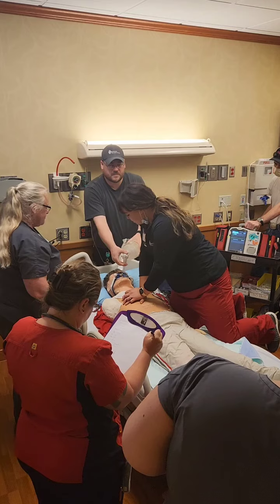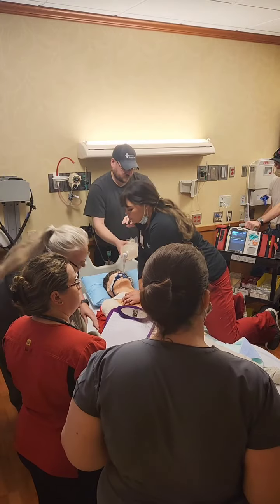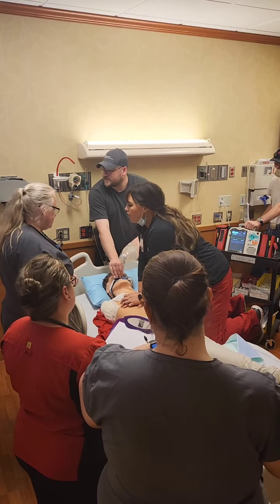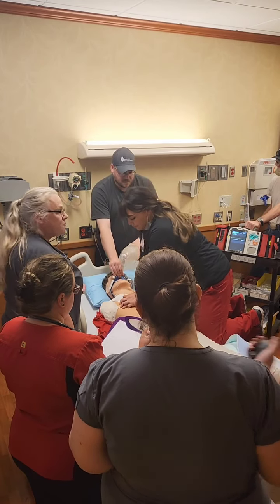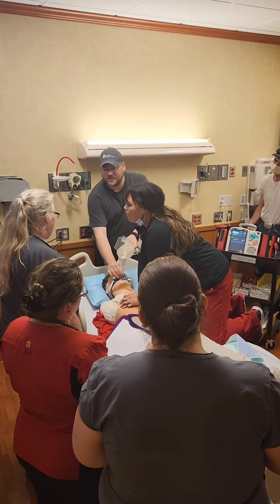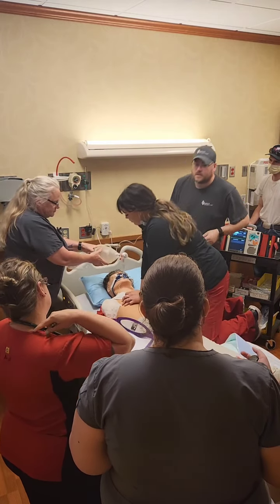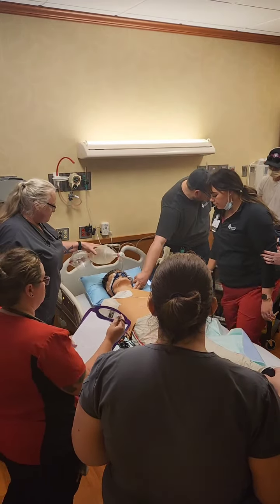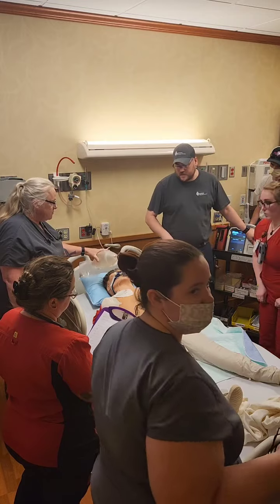Let us know when it's been 2 minutes. We have enough people out on the floor. Every 6 seconds. I just ran a check on my blood pressure. Eric, go ahead. I'll do the monitor. Liz, did you want to get in there? It's good to practice. 2 minutes. All right, go ahead, pause CPR real quick. Go for pulse. Still VFib. Charge again. You can still do compressions while it's charging.